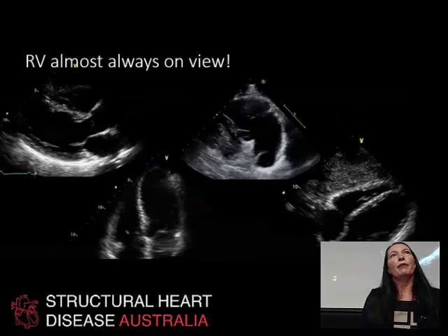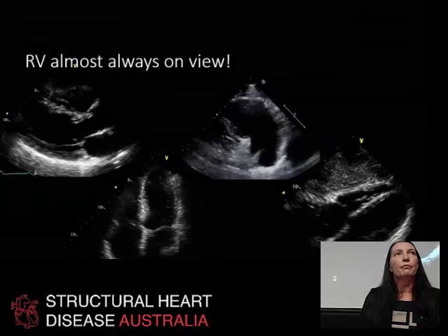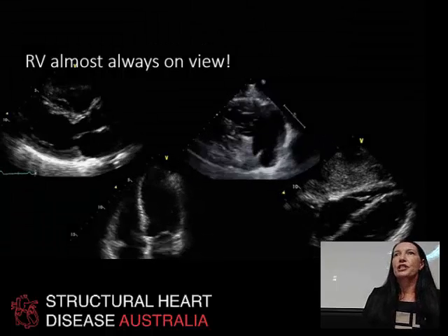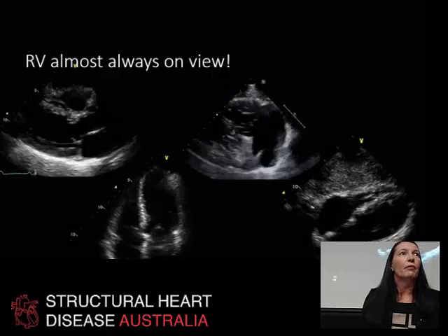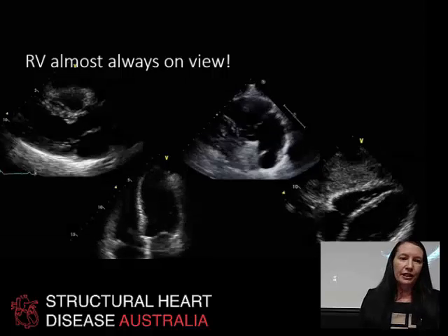But as per the big boat on the harbour, the right ventricle is always on view. Pretty much any probe position that you use with an echocardiogram, you can see the right ventricle. But we always look at the left ventricle. So let's take a look.